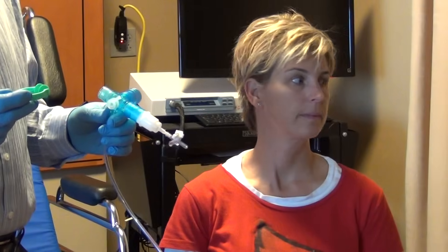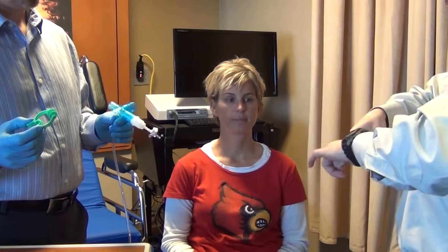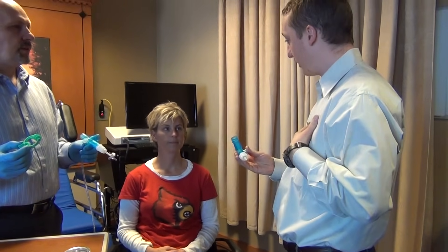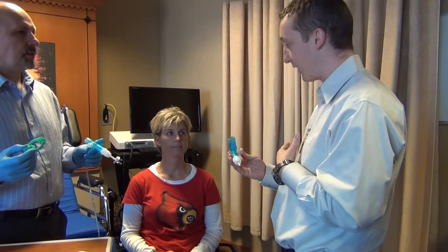This test is a little bit different. What you're going to do is flip the mouthpiece around. Same thing — bite down on the mouthpiece. Take a little bit of air into your lungs first so you have something to blow out through the mouthpiece.